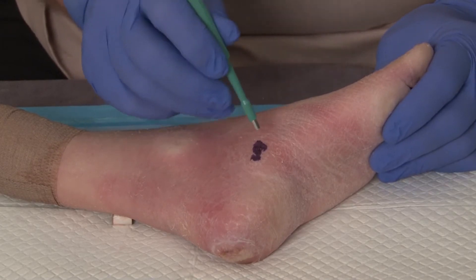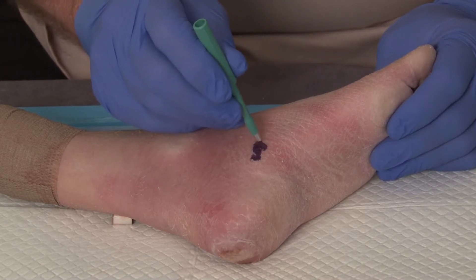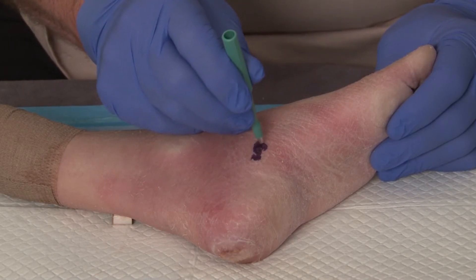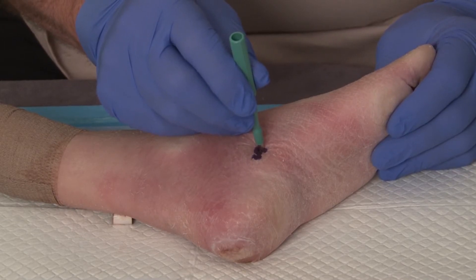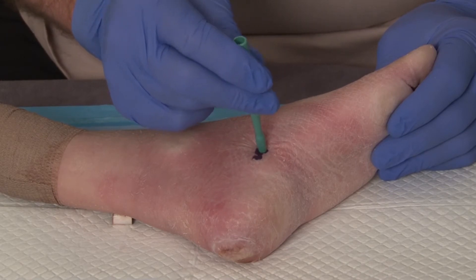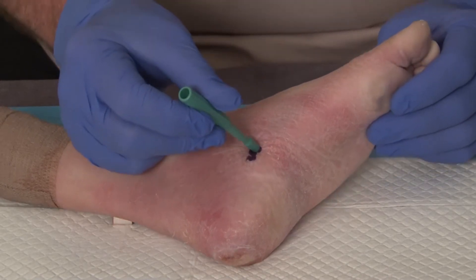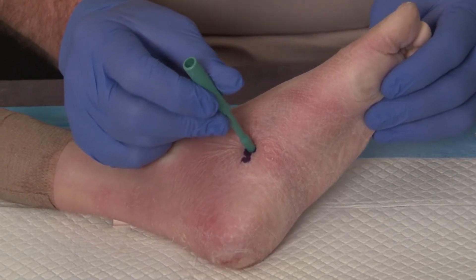The technique itself involves getting the darkest, most elevated, and most representative portion of the lesion, putting the punch biopsy in so that we have no normal skin — only abnormal skin — and we're simply rotating back and forth gently until the instrument penetrates to the depth of the subcutaneous tissue.